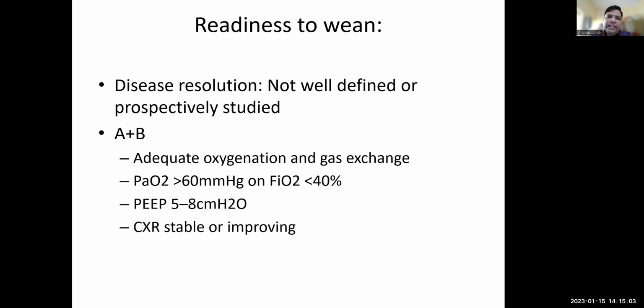The first thing that is said in all textbooks is to make sure that the disease is either largely taken care of, or it has improved significantly to a point that this patient does not need mechanical ventilation for whatever reason it was started.